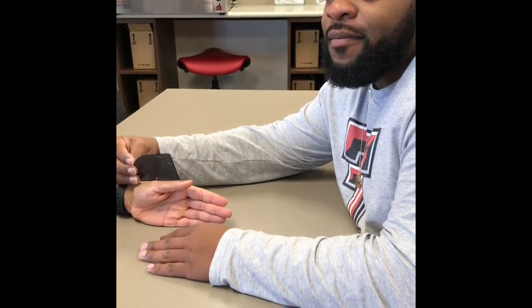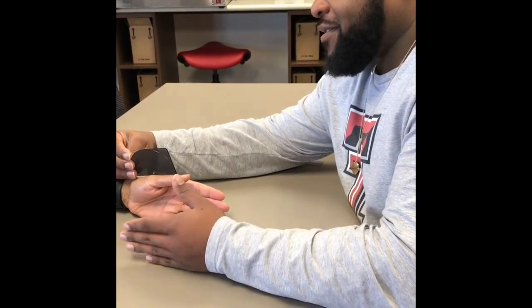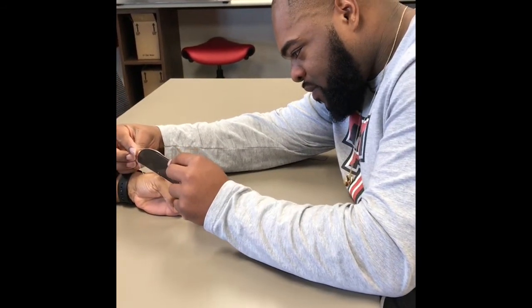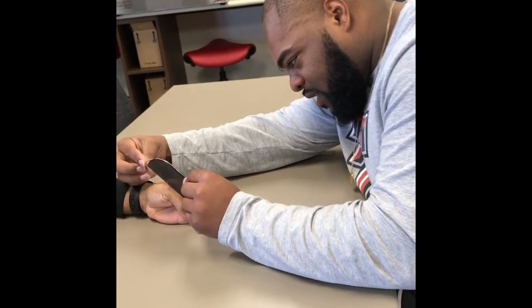For this one, we're going to be doing the MCP flexion of the thumb and the normal range is 0 to 50, so if you would, push your thumb in. He is at 55.